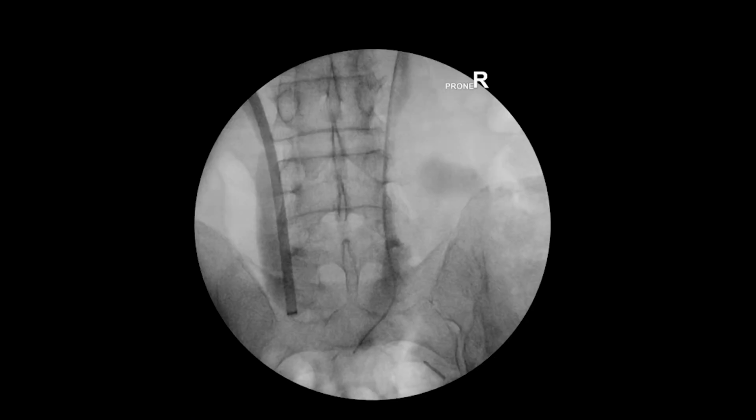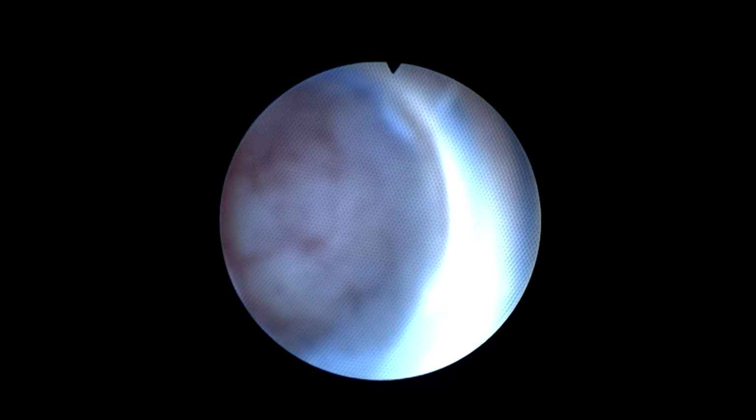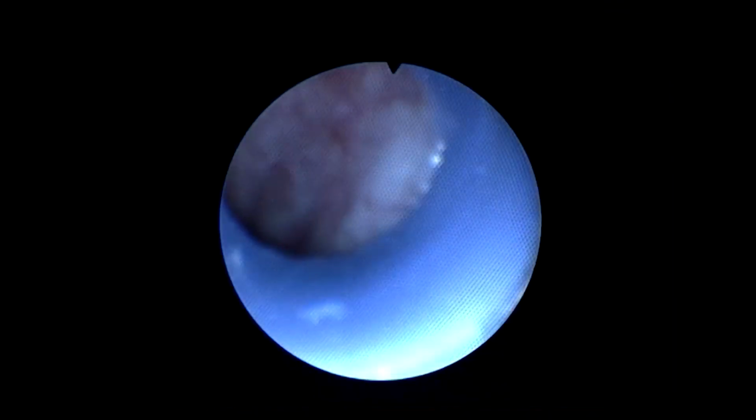So having tried the left-hand side, you can see we've now got wire access down the right ureter, and we go through exactly the same process on the right. We pass an 11-13, 26 centimeter access sheath down into the lower ureter. We're going to go antegradely down the right-hand side to try and find our stones. And in fact, on the right-hand side, we do manage to get down to some stone.